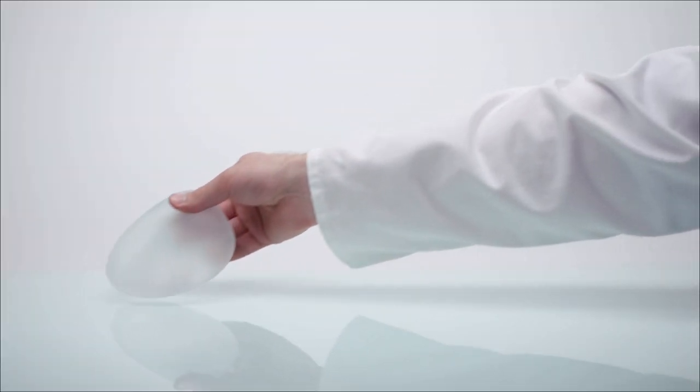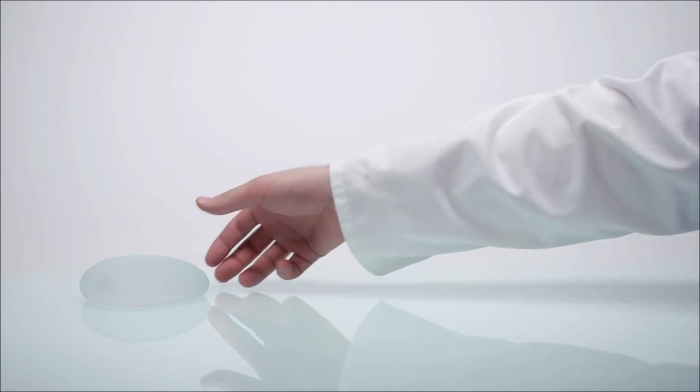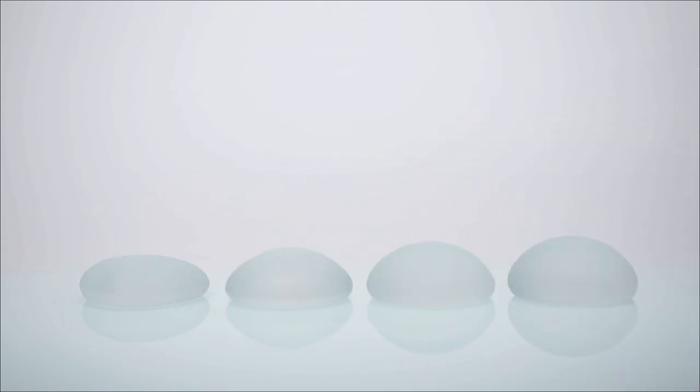Most patients have their breast implants for many years with no complications that require them to access their implant information or guarantees, so it can be easy to misplace or otherwise lose track of that paperwork.